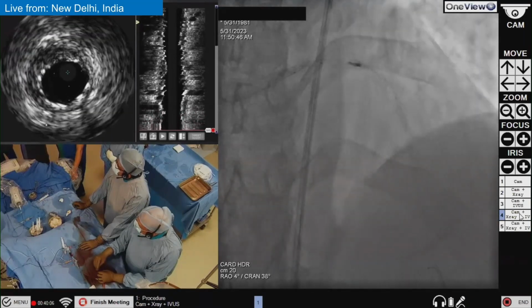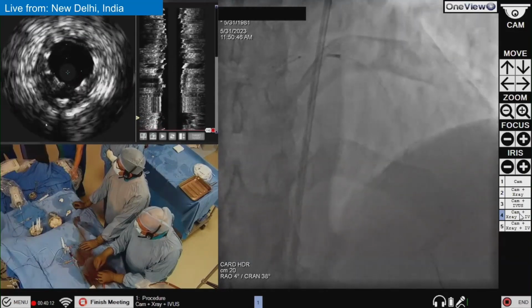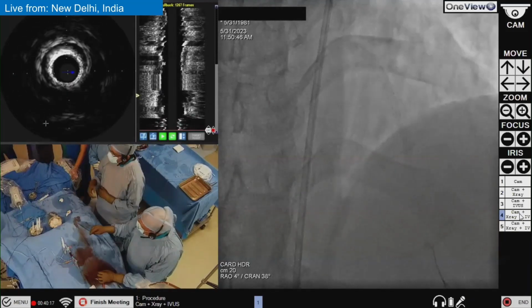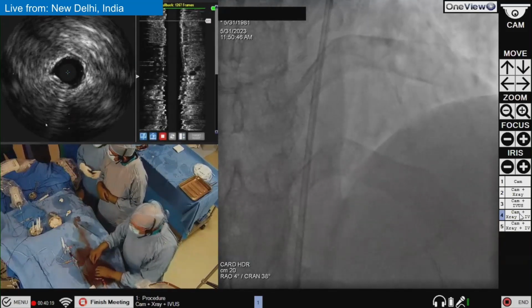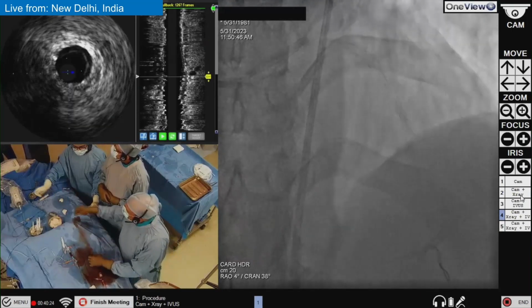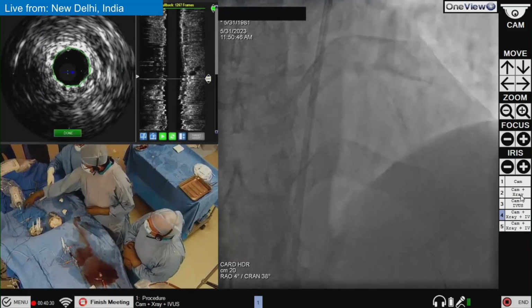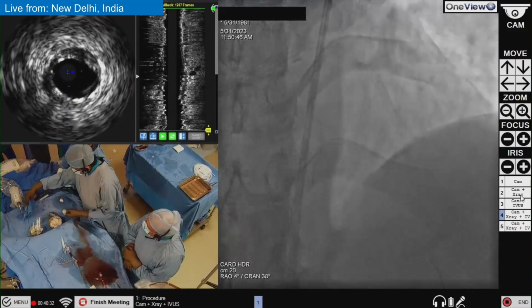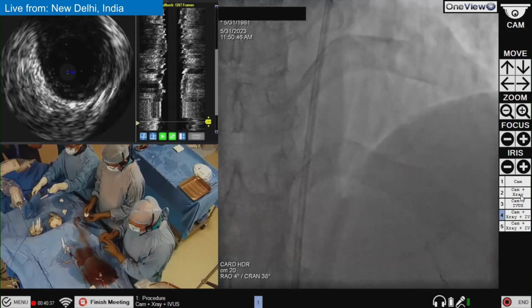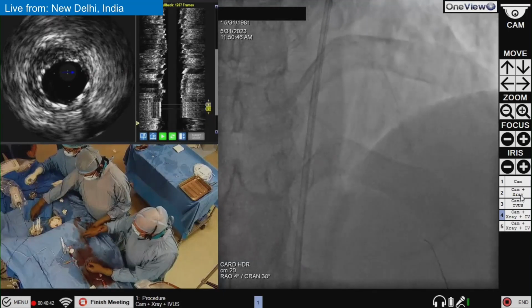There is some fibrous plaque at the 11 o'clock position. And now I think we have caught the ostium perfectly. Yes, perfect. Just at the ostium we have landed. So it's good. Can you just review it? The distal edge is looking fine. The proximal edge is also fine. Okay, perfect. So according to IVUS imaging, everything seems good.